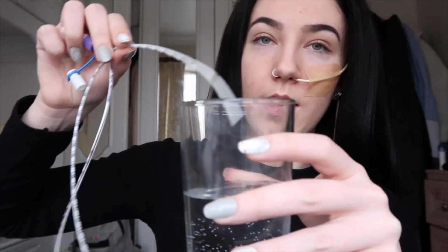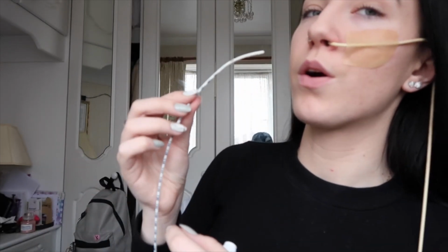Right, so I'm going to dip it back in the water. Just like that. Now, your natural reaction is going to be to push straight up. No. What you want to do, if I go on the side, you want to push as in you're pushing down the back of your throat. You want to be putting it along your nose and pushing, okay? I'm probably going to look weird. My eyes are probably going to water. It happens every time. I've placed NGs lots and lots of times, and it still makes my eyes water.